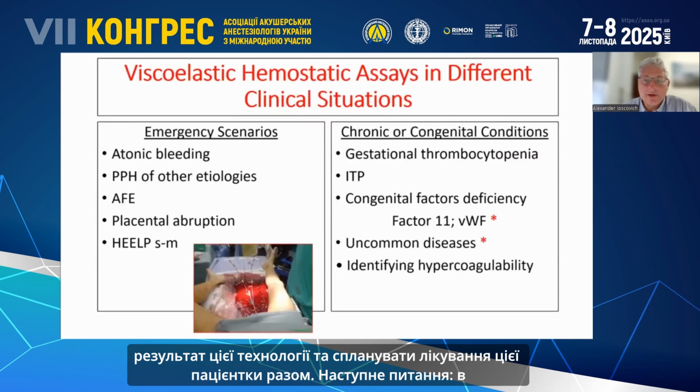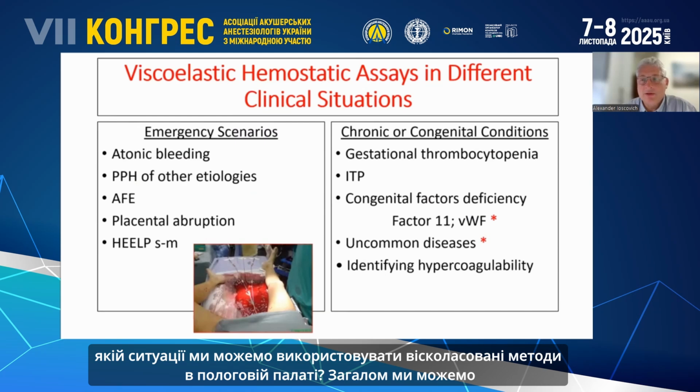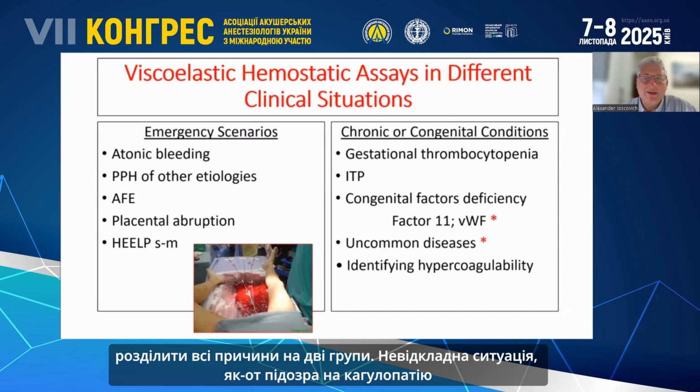The next question: in which situations can we use viscoelastic methods in the delivery room? In general, we can divide all reasons into two groups.